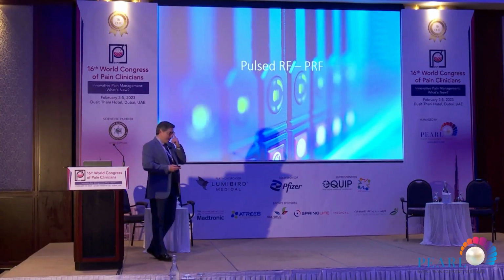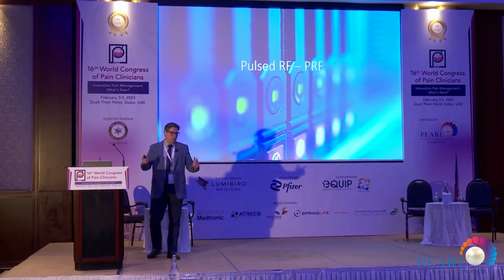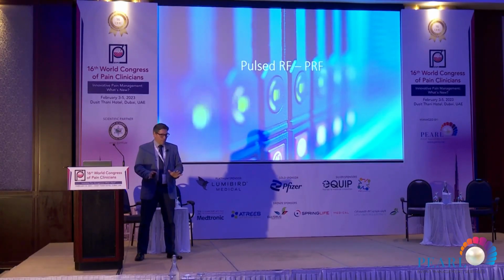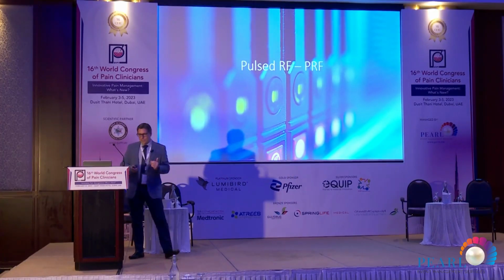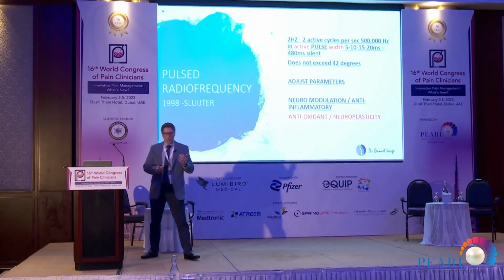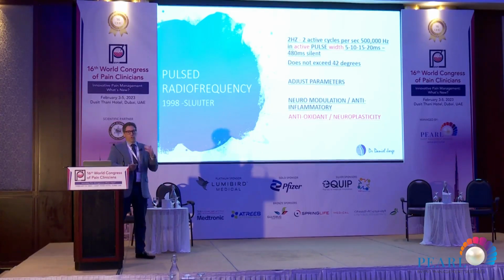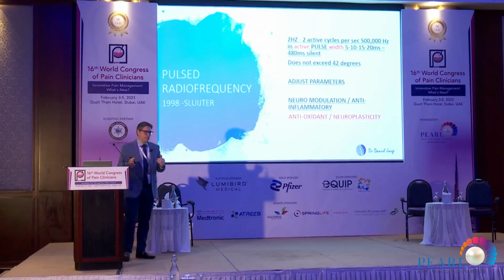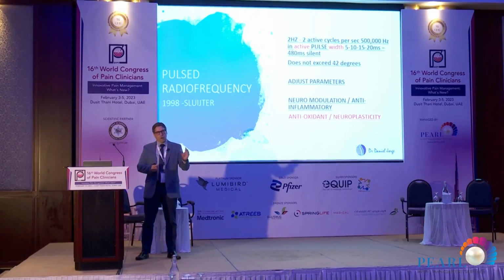With this kind of treatment, what we are doing is making a silent period, and we are cooling down the system between those active pulses. And we can adjust our parameters to make the treatment as effective as possible. When we have a treatment using 2 Hertz, for example, or 5 Hertz, we are using 2 pulses in 1 second or 5 pulses in 1 second.